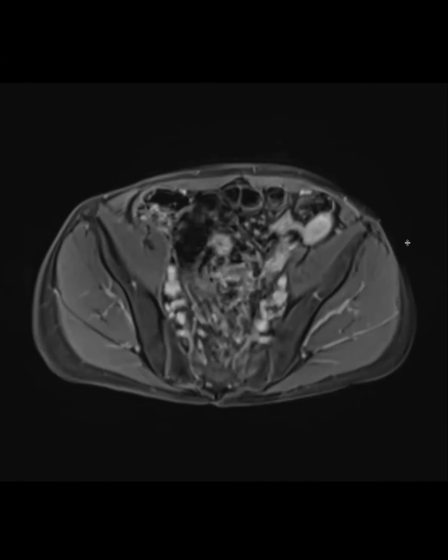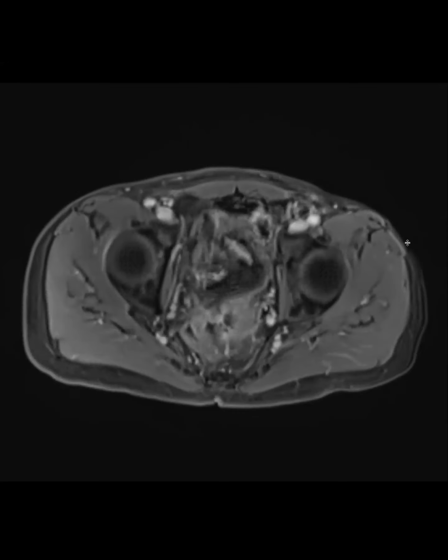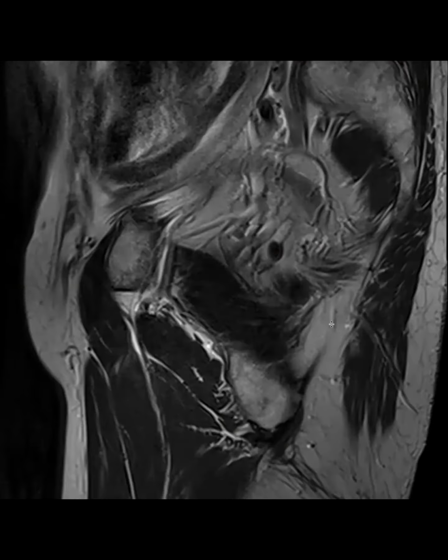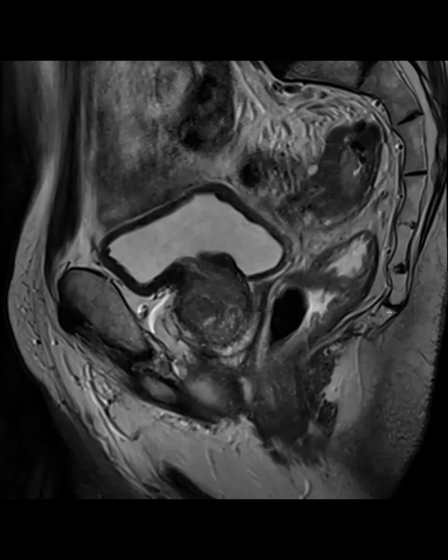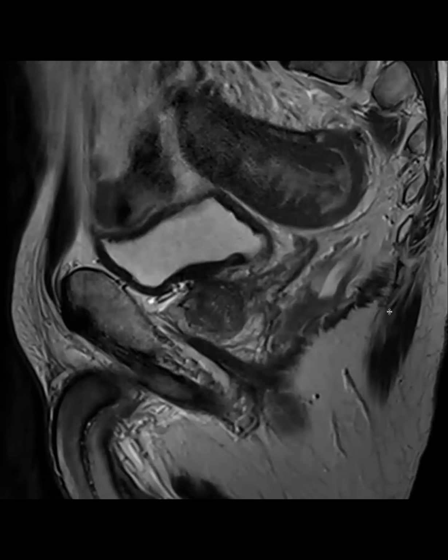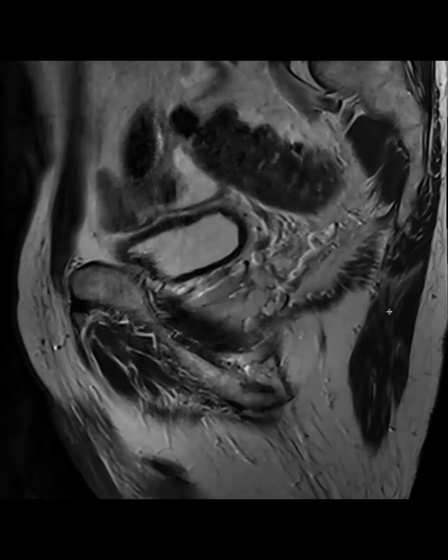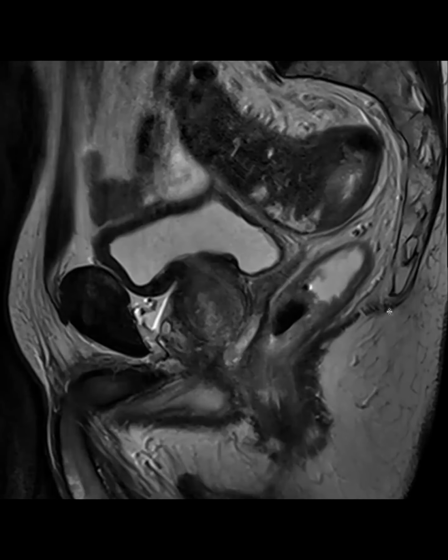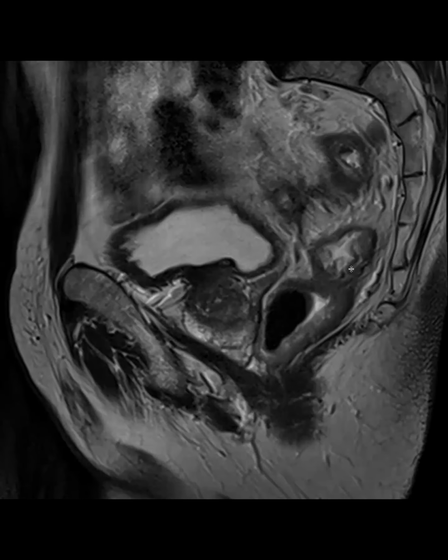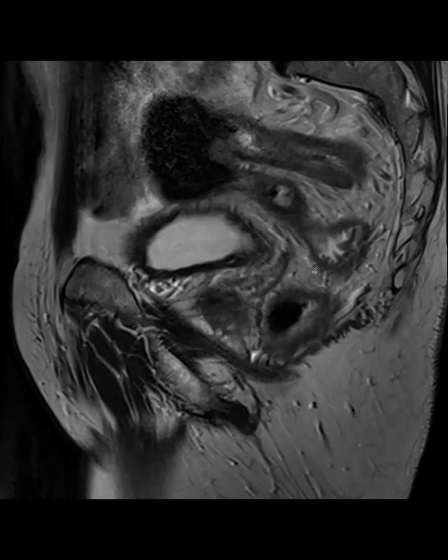What's that big thing coming off the bowel? Yeah, what is that? Here, let me show you. Here's our small field of view. It's like a really thickened segment of bowel with, wait a second. Yeah, so going in two different directions. So here's the rectum, oh, it's the fistula.